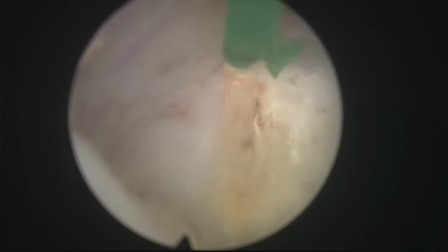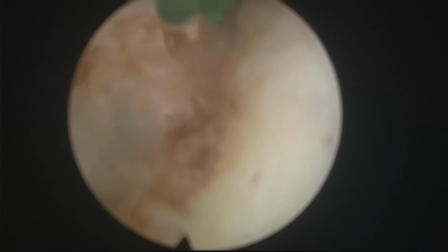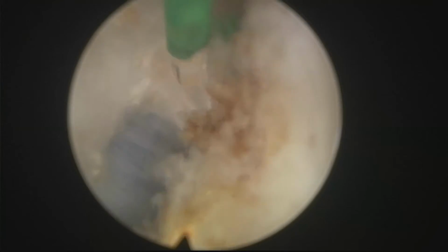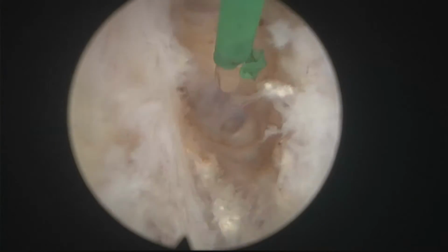And the objective of this operation was to try to make sure that this man who was operated once and now has to be operated a second time will never need a third time, if it's possible. So trying to remove the residual adenomatous tissue that will certainly grow if it is left there, maybe causing the need for a third operation in the future if we only removed the stone.